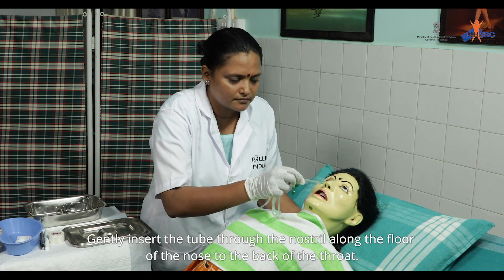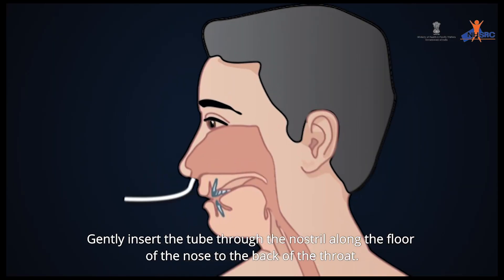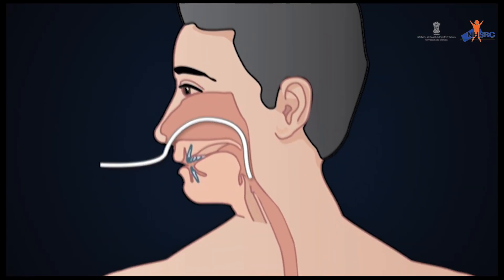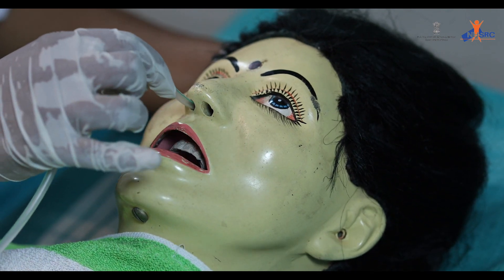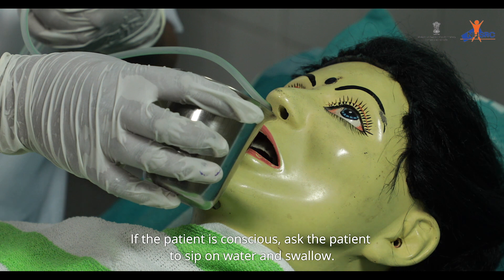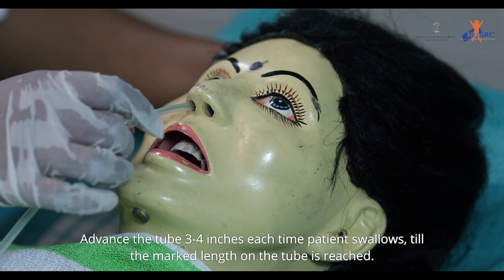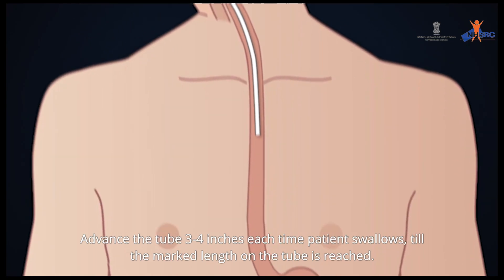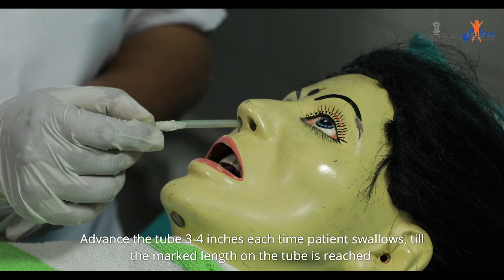Gently insert the tube through the nostril along the floor of the nose to the back of the throat. Keep the patient's head slightly flexed. If the patient is conscious, ask them to sip water and swallow. Advance the tube 3 to 4 inches each time the patient swallows, until the marked length on the tube is reached.